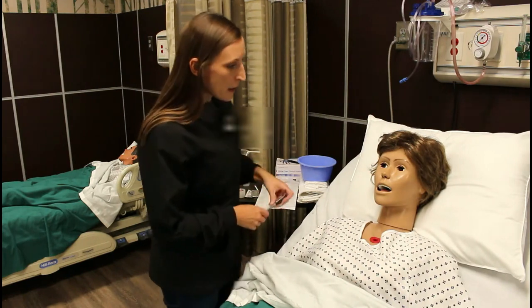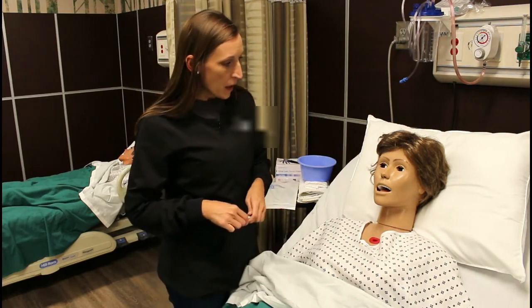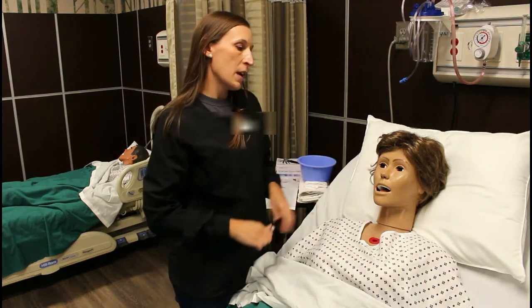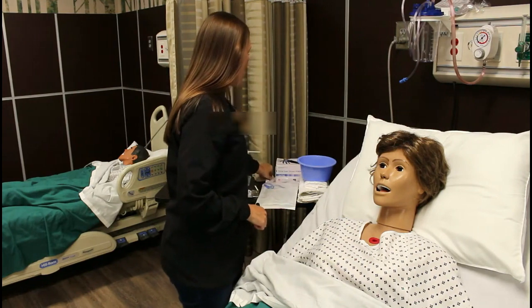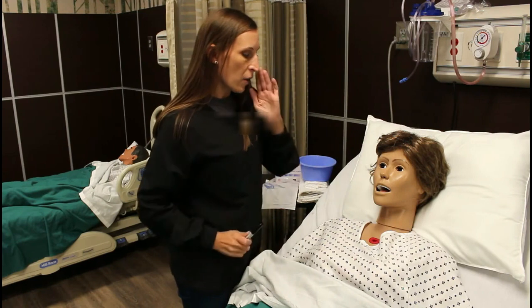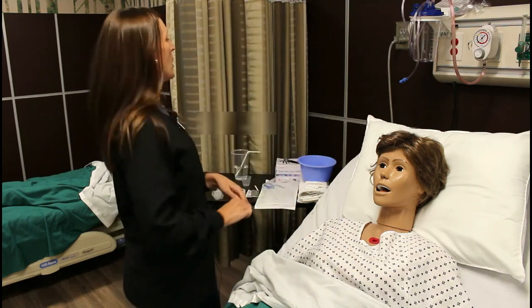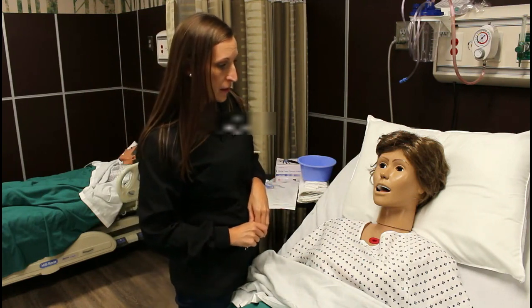Have you had a history of any nasal surgeries? Have you ever had a deviated septum? Do you have any nasal polyps? Let's determine which nare we want to go in — I'm just going to take a look with my pen light. Could you occlude one side of your nose and breathe in, then the other side? I'm going to ask you to blow your nose. Could you breathe in and out of both sides and tell me which side feels more clear? Okay, we'll use your right nare to put in the NG tube. Can you also swallow and cough for me so I can check your gag reflex? Okay, great.